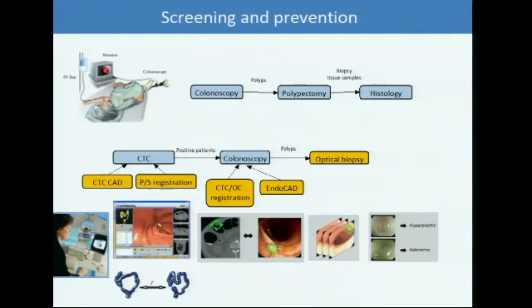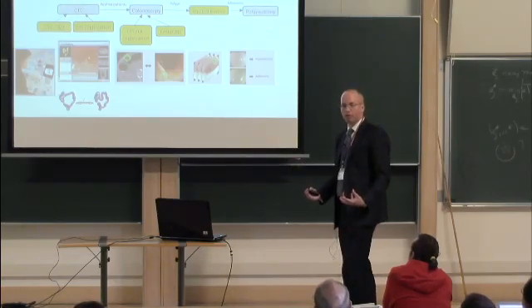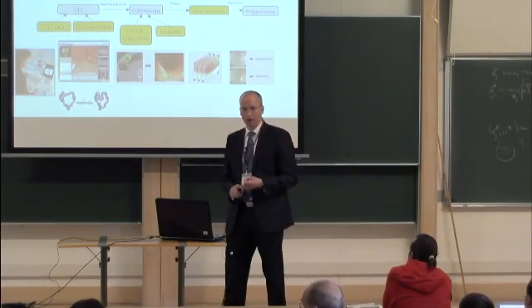And rather than remove all polyps, what we're working on is an optical biopsy algorithm to determine directly from the image alone whether a polyp is adenomatous or hyperplastic. The adenomatous polyps are the ones that need to be removed. So this is the pipeline that we're working on at MedicSite, and we believe this can be transformative for patient care in colorectal health, both for the patient outcome as well as saving hospital costs.